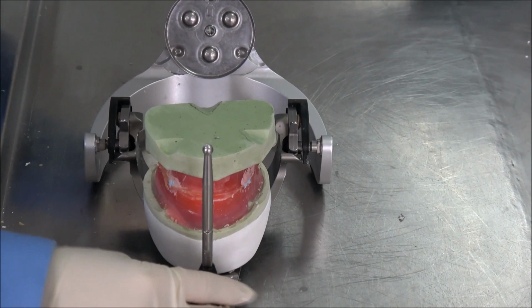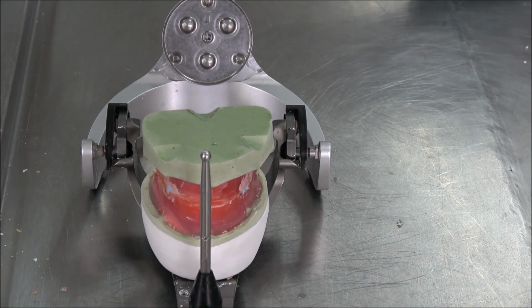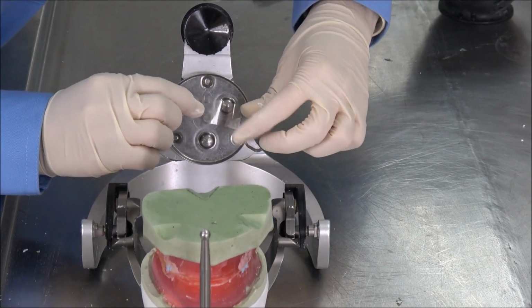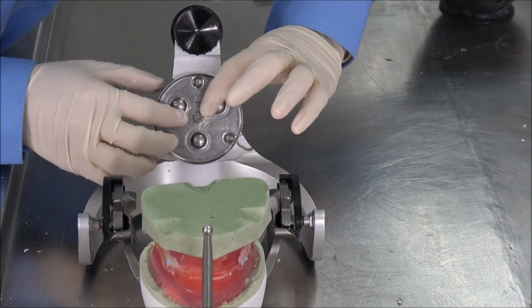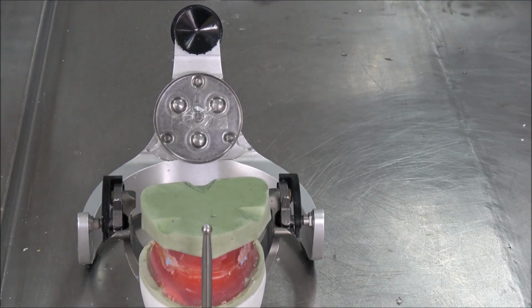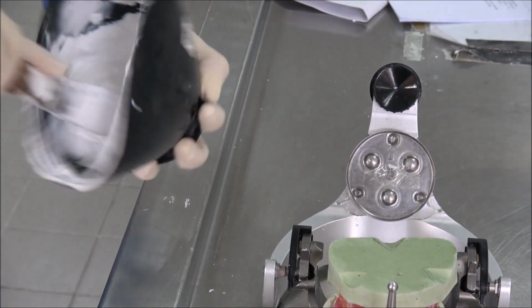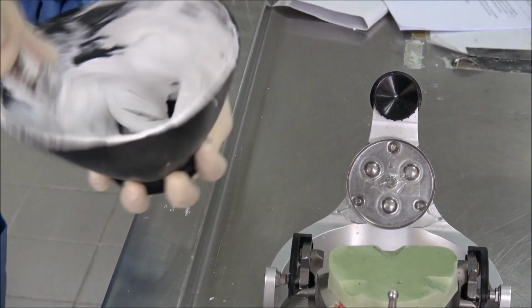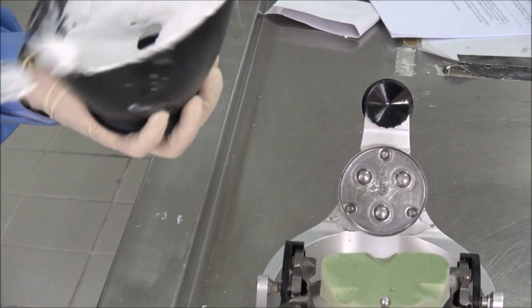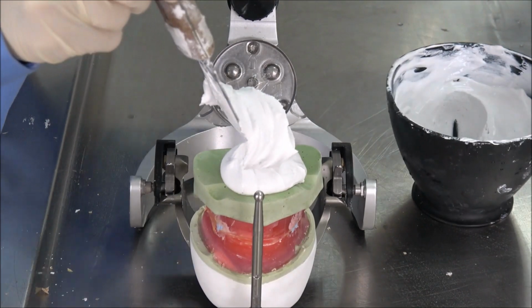We put our articulator facing this position to keep it stable. Before we put our POP, make sure don't forget to put a cellophane tape on the middle of the mounting plate to cover the hole. After that, we mix our POP. Make sure you mix your POP properly and evenly. Make sure the ratio follows our requirement. Now we start. Put our POP on top here, a little bit.